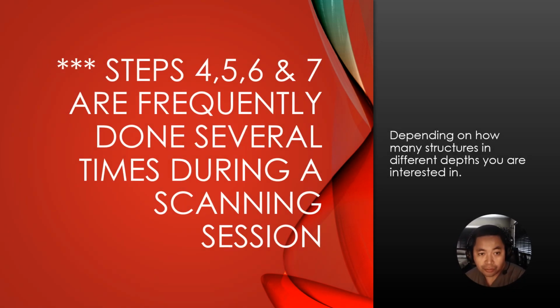Before I continue with the next slides, let me emphasize to you that steps 4, 5, 6, and 7 are frequently done several times during a single scanning session. And this would be dependent on how many structures at different depths you are interested in. So this is not usually just done once during an ultrasound examination.